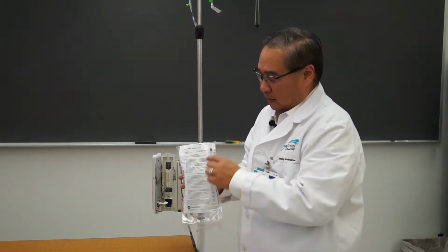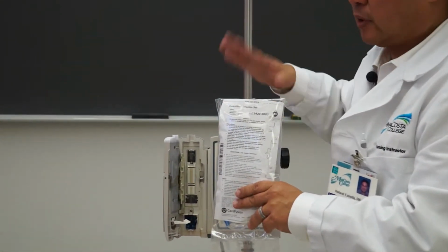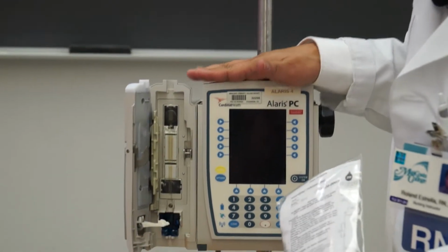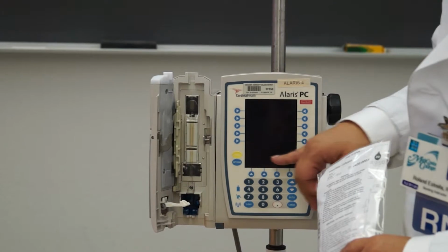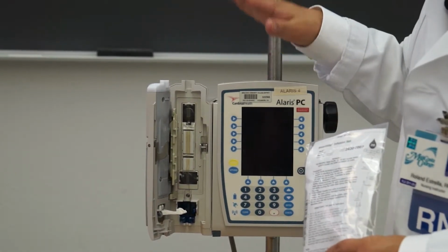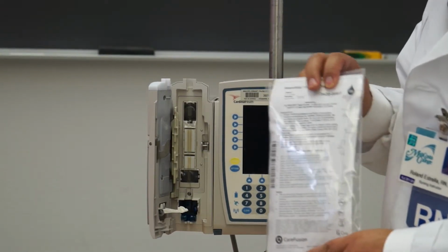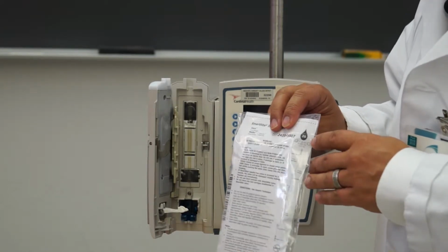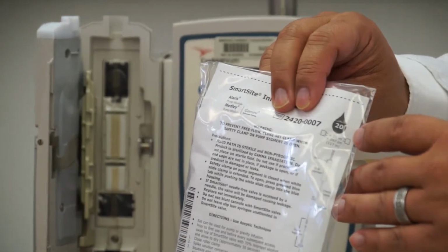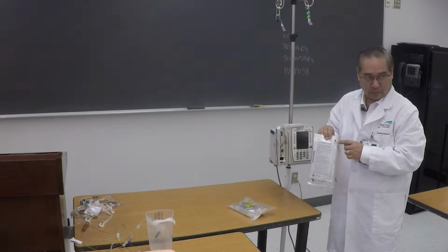And that means that if you were to run this, say the pump breaks for whatever reason, there's some kind of disaster and there's no more power, there is an internal battery inside the pump which would list the amount of battery life in bars. Now say it ran out or there's a malfunction, there's nothing else available, we can convert this into a gravity setup. So this number will tell you how many drops per milliliter it would be. So when you do your calculation, you would run the calculation using 20 drops per milliliter.